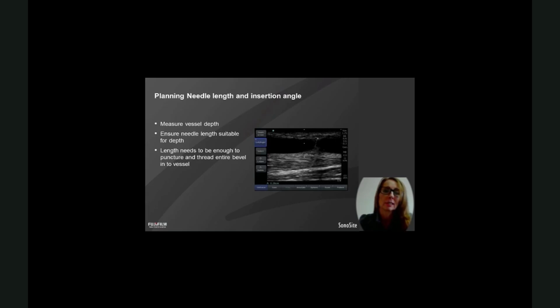You think this big aneurysmal fistula should be punctured very quickly, but when you put the ultrasound on, you realise there's a little bit of thrombus just lining the lumen, and actually to puncture into the blood, it's 5 or 6 millimetres deep. Sometimes I find that people are a bit confounded with the big aneurysmal fistulas and they don't realise they're actually deeper than they look.